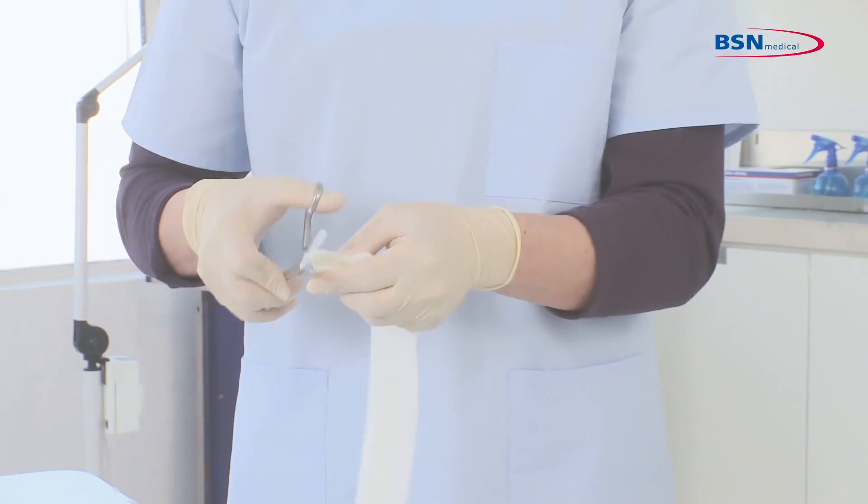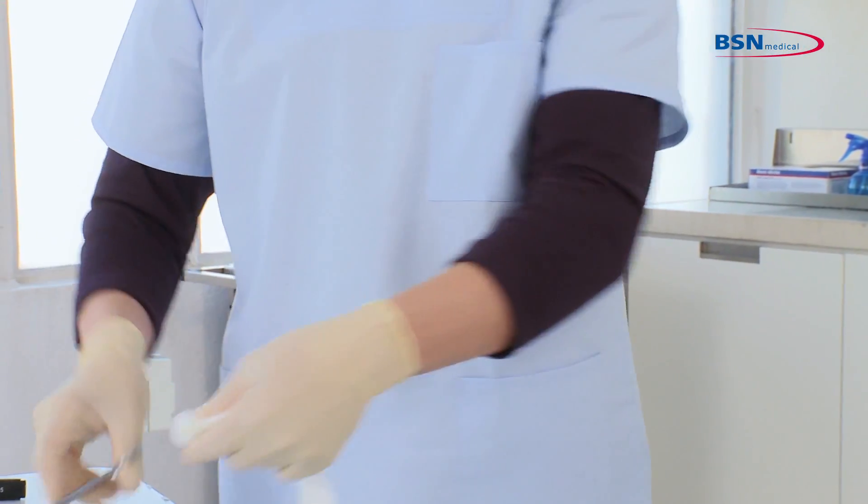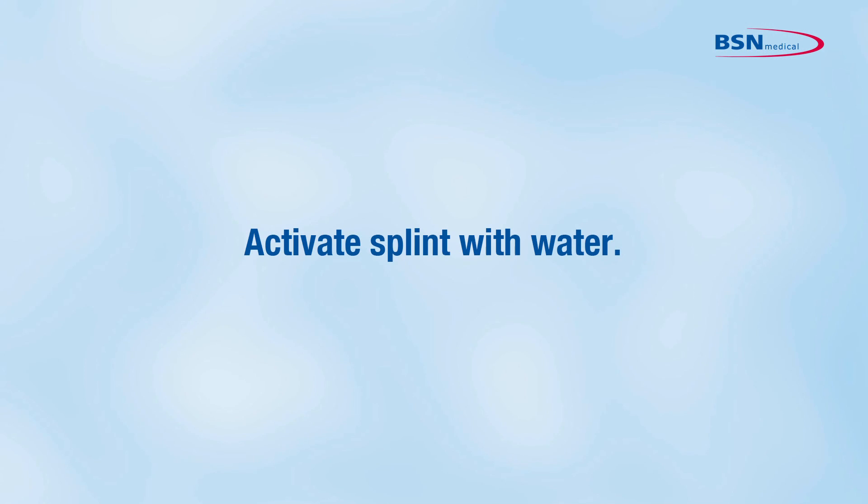Cut the needed splint length and round the edges. Activate the splint with water.